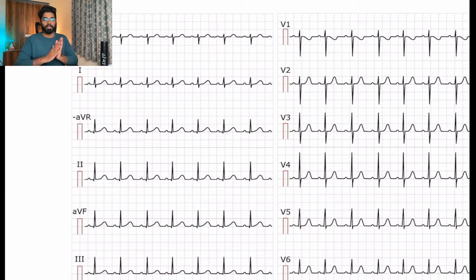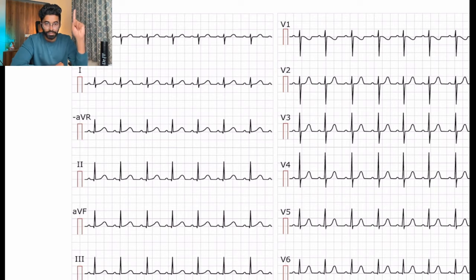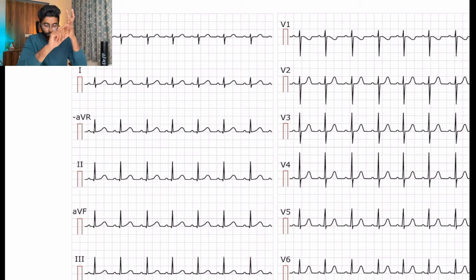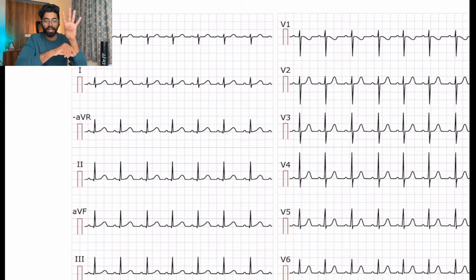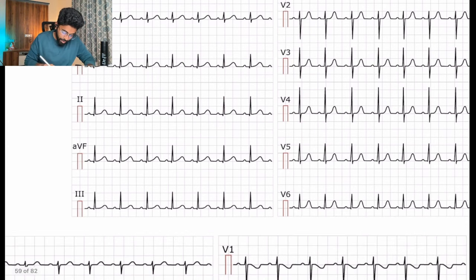You can interpret the ECG by just four points: first, look into the heart rate; second, see whether the rhythm is regular or not; third, assess the P wave and the PR interval — is it normal or not; and fourth, look at the morphology of the QRS. With these four points you can clearly interpret an ECG in just 30 seconds.